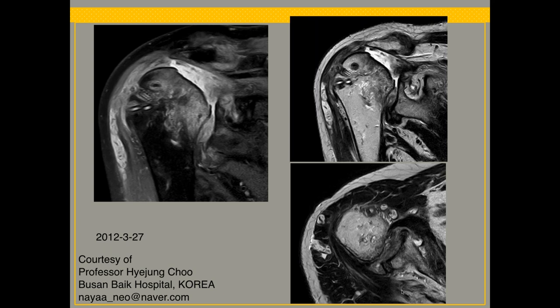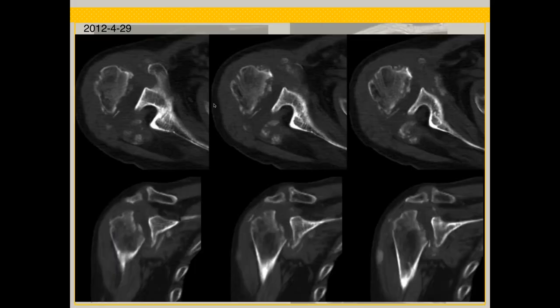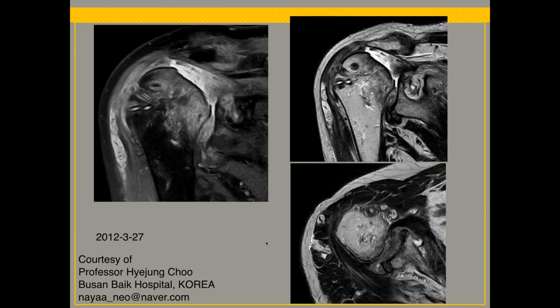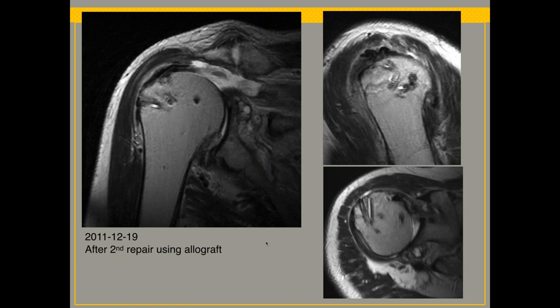There's fluid, there's synovial hypertrophy. We have fracture or depression of the humeral head superiorly. And a lot of edema in the bone. A lot of bony erosion, those calcifications in the joint. Real destruction. Yeah. Extensive destruction of the humeral head now. Okay. So what do you think is going on here? Infectious process.